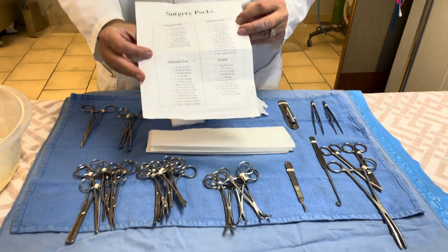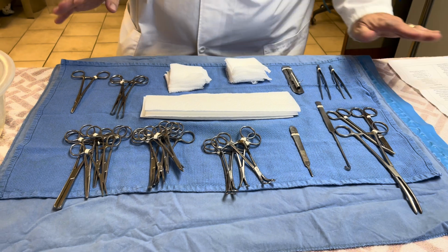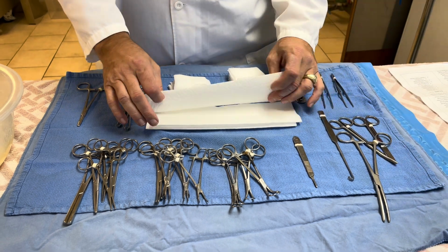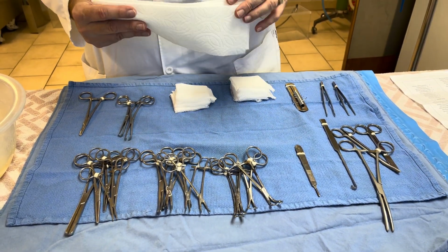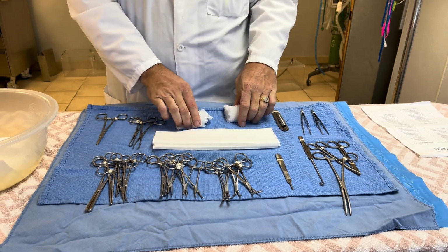All right, so I've got everything separated here by the type of instruments that they are. You have your little paper, your list of what goes in each pack, okay? And so what you'll start with is paper towels. You put your pack wrap, your huck towel, and then paper towels, okay? You want at least 2 paper towels of the full size kind. These are 3 here, this is fine for this. And we fold these in half. And so that's where we start putting our stuff, okay?